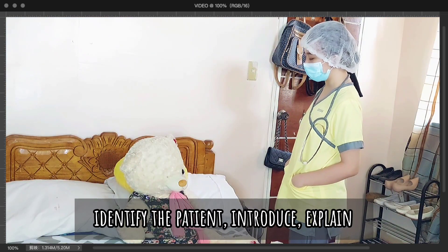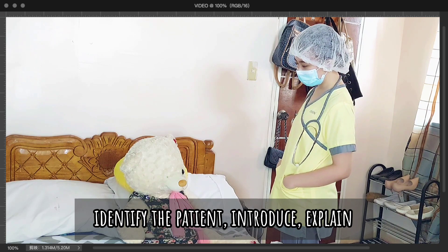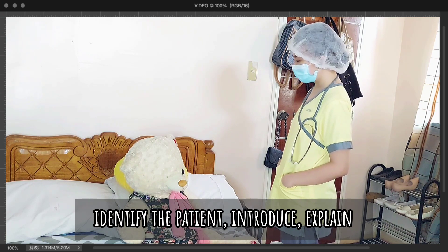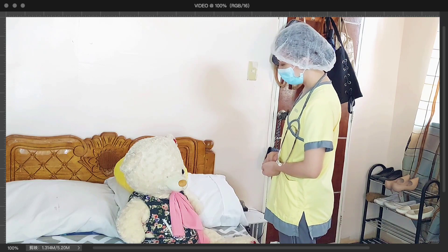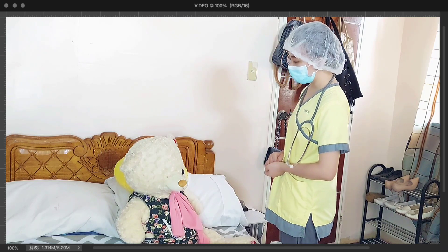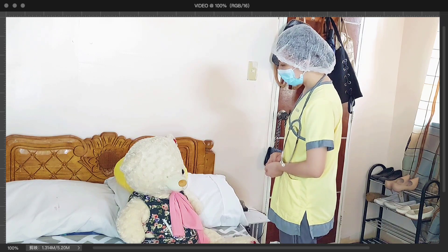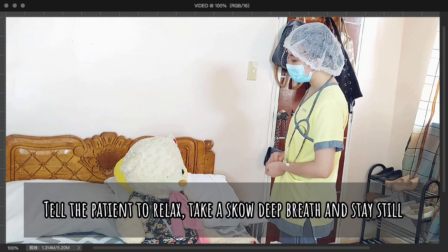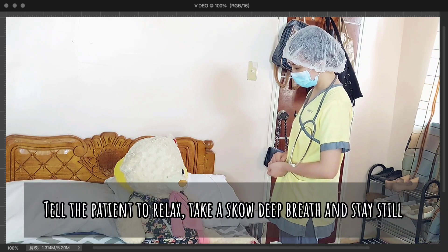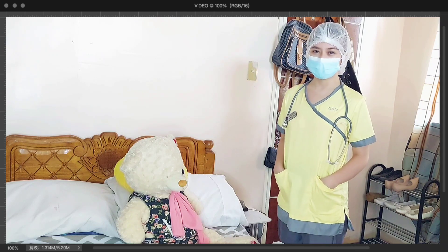Good day, Ma'am. I am your nurse again for today. You can call me Nurse Roxane. Can you state your name? Ma'am, you will be undergoing emergency management for your postpartum bleeding by means of a uterine balloon tamponade. I will insert a balloon and inflate it in your uterus to stop the bleeding. Please take a deep breath and stay calm. This will help to reduce the anxiety of the patient.